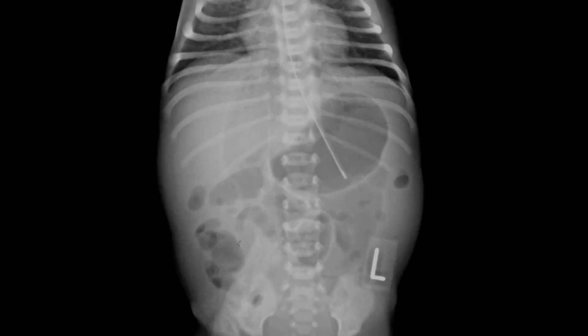So here is an example: a patient with necrotising enterocolitis. Here is the football sign of pneumoperitoneum, and you can see the falciform ligament here. That's because the falciform ligament is tangential to the incident beam.